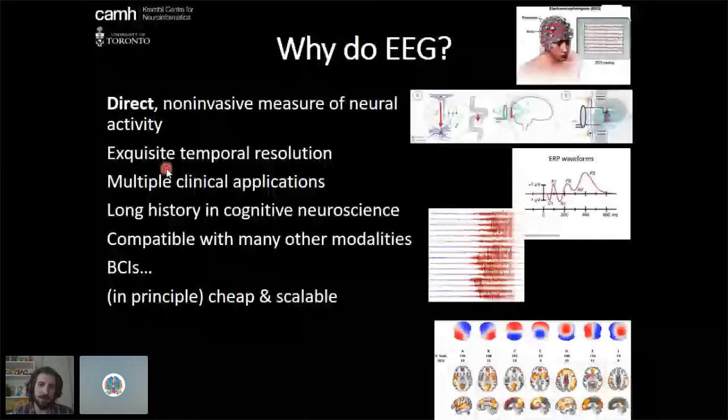And so this is the kind of thing that you're normally thinking about with EEG or with cognitive neuroscience type EEG experiments. You have these waveforms that have these inflections, or components, at certain characteristic time points, like 100 milliseconds, 200 milliseconds, 300 milliseconds, and they have this wavy shape.